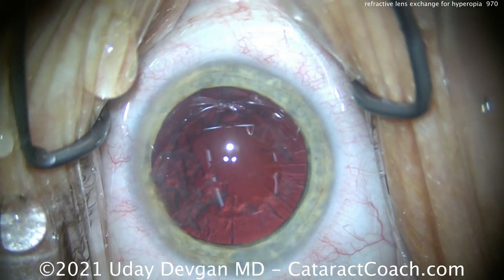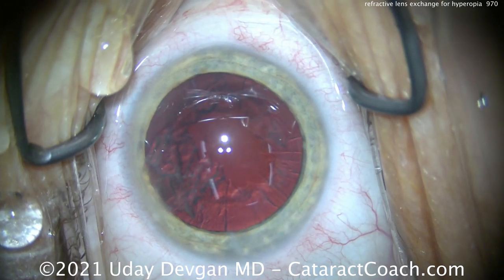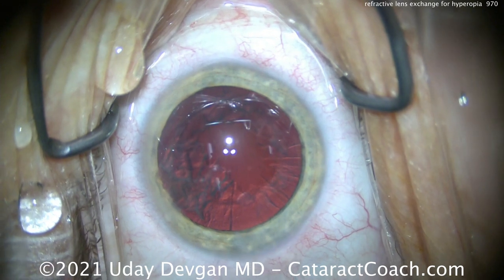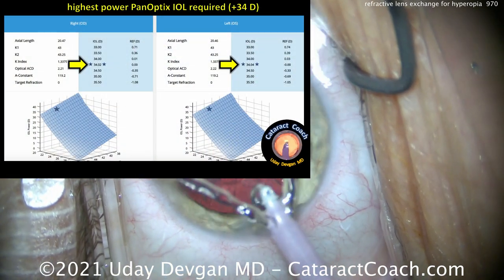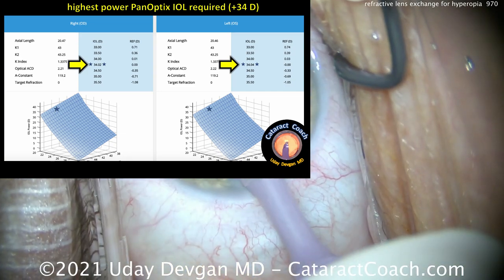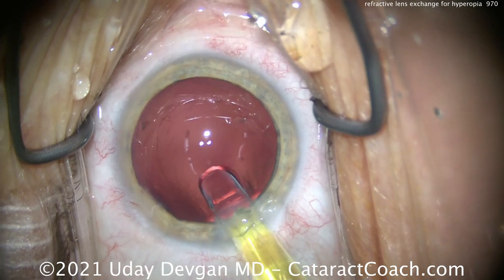We quickly remove all the lens nucleus — that comes out pretty easily. We're very careful to keep the chopper in that safe position. For the lens calculations, we want to make sure we're going to hit our target, which is going to be a plano outcome. We do our calculations and see that it's a 34-diopter lens in each eye, using iolcalc.com.